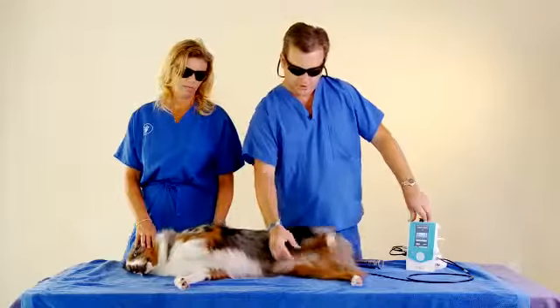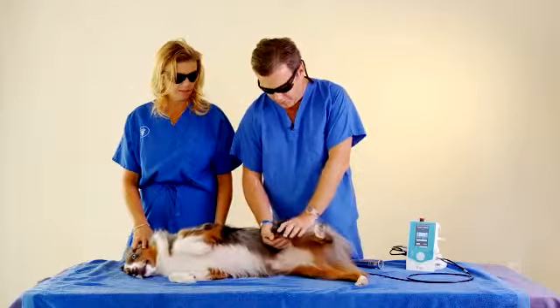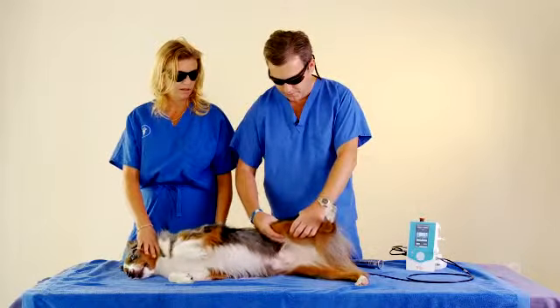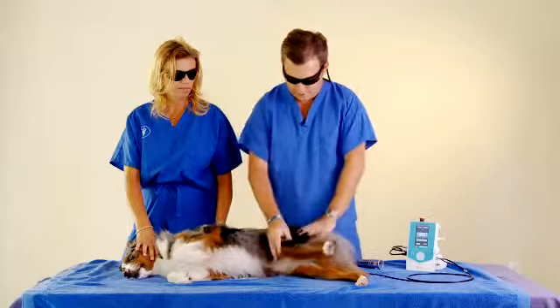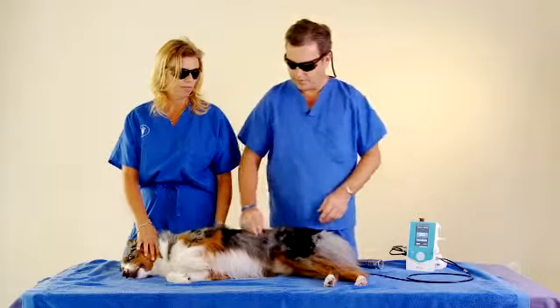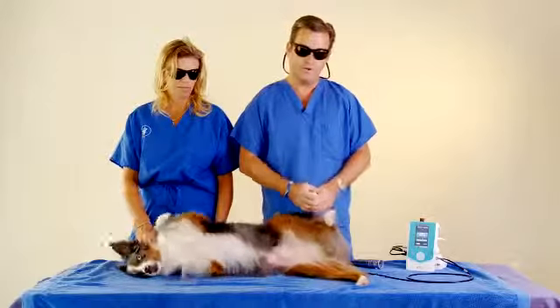So you have to consider the area that you're going through. He's going to be a little submissive with us today. If we're just focusing on the stifle here, it's a small area, so it's not going to take the energy of, let's say, his back or his hip. And also, if you have a really small dog and you're doing a carpus or tarsus, you want to consider this a very small area volume-wise.